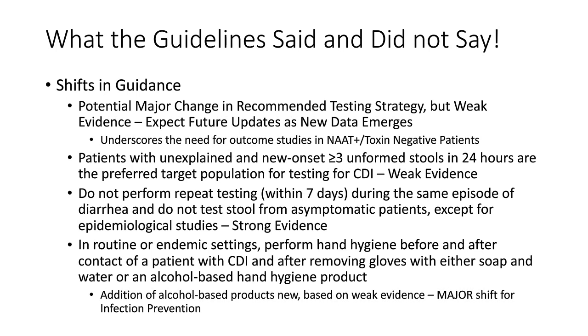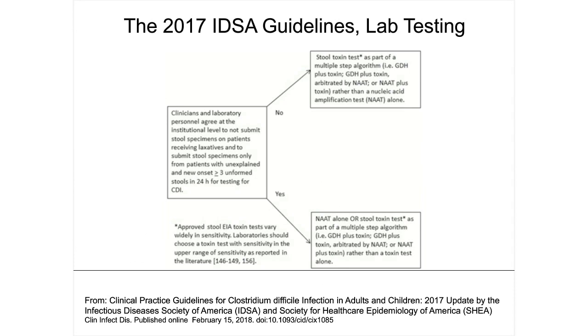epidemiologically driven guideline. As you can see, and this is one of the figures from the guidelines, the first factor you need to consider when evaluating what testing methodology to use comes down to: are you doing a good job at the pre-analyticals? Can you, as a healthcare institution, control for not receiving specimens from patients that are on laxatives?